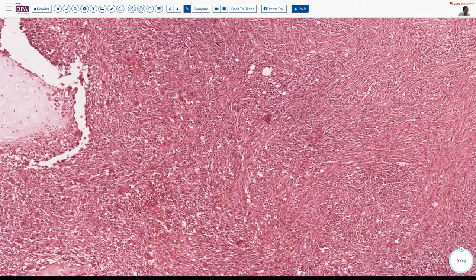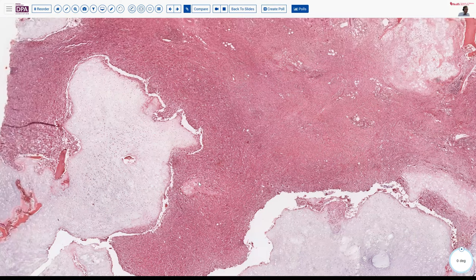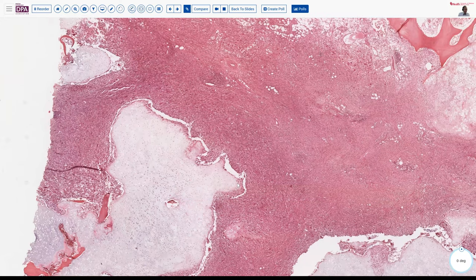So we have here the phenomenon of dedifferentiation. There are a number of situations in pathology where we, of course, encounter dedifferentiation, endometrial tumors, lipomatous tumors, and so forth, some of the more common ones. But cartilage neoplasms also can dedifferentiate. And the hallmarks are the radiographic findings of a change in symptoms, lucency around a more indolent lesion, and histologically, we look for a low-grade lesion, low-grade malignancy, like this low-grade chondrosarcoma, with a biphasic or more high-grade area adjacent to or surrounding that lesion.